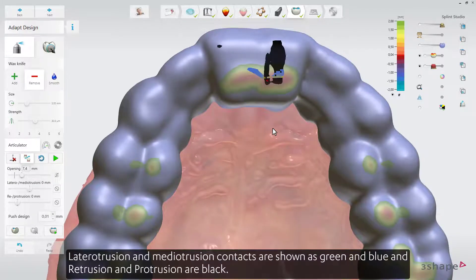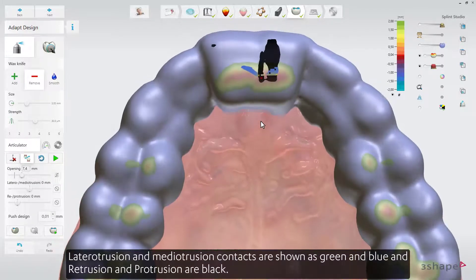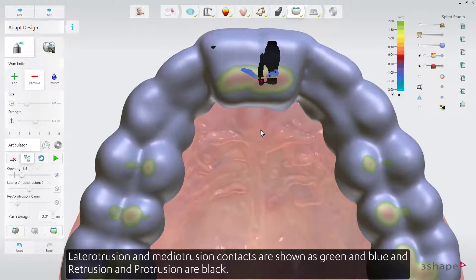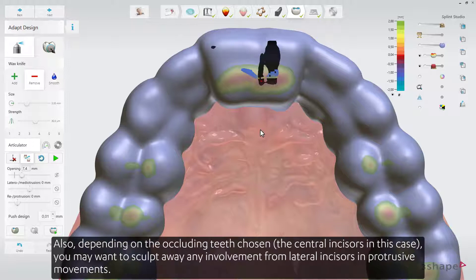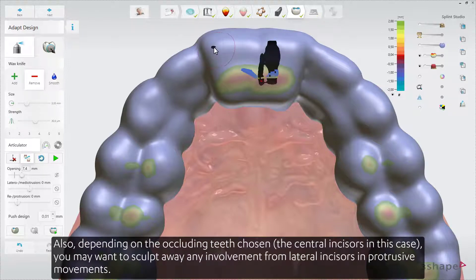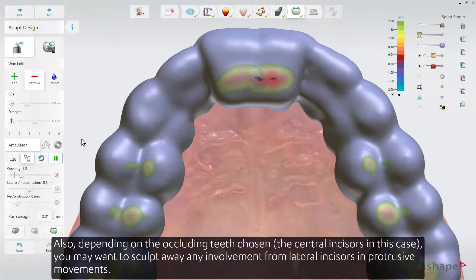Laterotrusion and Mediotrusion contacts are shown in green and blue, while Retrusion and Protrusion contacts are shown in black. Depending on the occluding teeth chosen — the central incisors in this case — you may want to sculpt away any involvement from lateral incisors in protrusive movements.